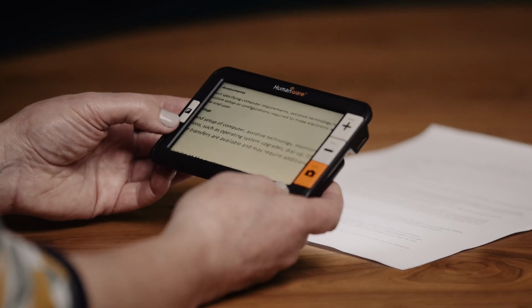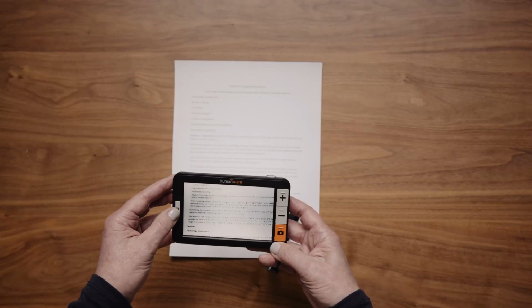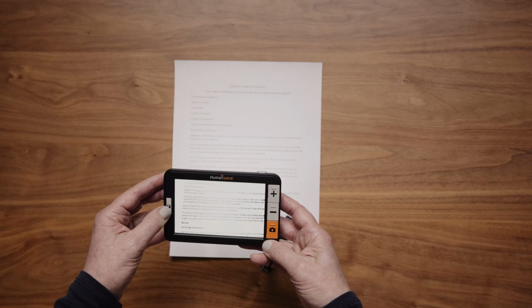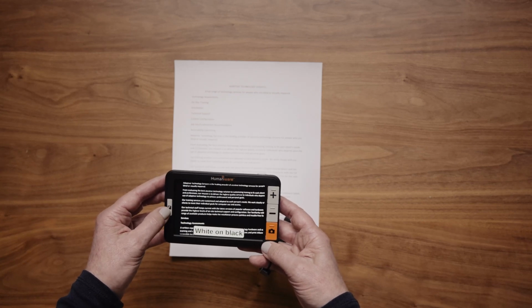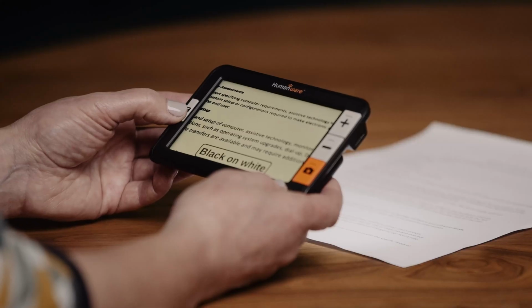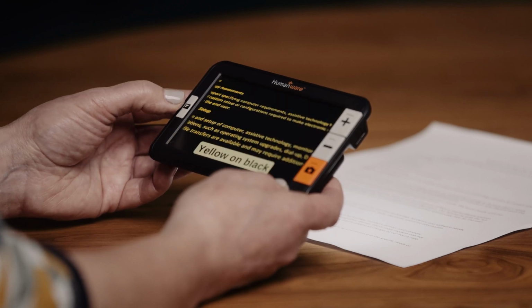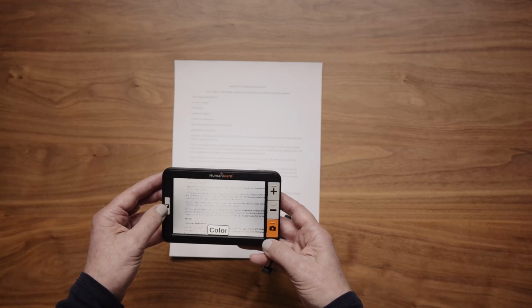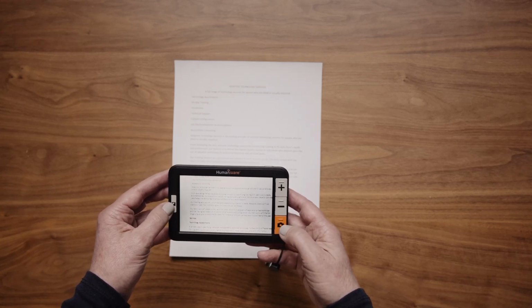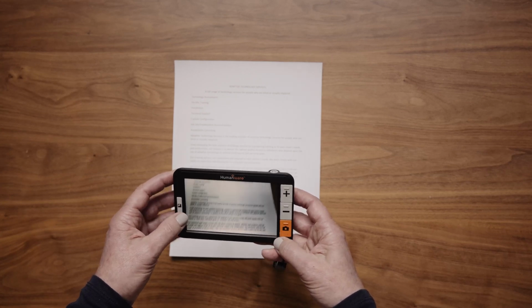Change contrast. 1. Press the contrast button to change the contrast of the text and background. Press it repeatedly to cycle through the different contrast schemes. They are by default full color, black on white, white on black, black on yellow, and yellow on black. Note, it is possible to add or remove contrast color schemes. This topic will be addressed in the Settings menu section of this tutorial.